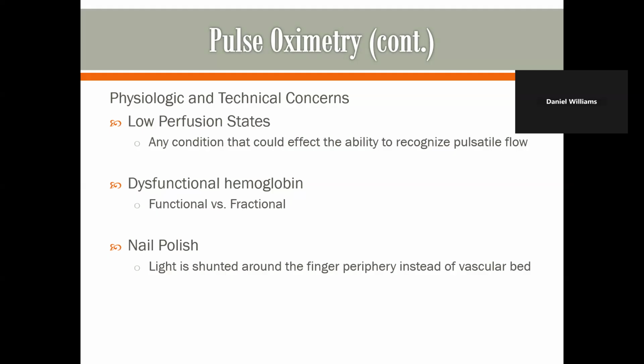If you've got someone that's been pulled from a burning building, they may have carboxyhemoglobinemia. Hemoglobin has an affinity for carbon monoxide 210 times greater than that of oxygen, so carbon monoxide binds more readily with hemoglobin. Pulse oximetry can basically only determine that something is bound to the hemoglobin, but can't distinguish what is bound to the hemoglobin.